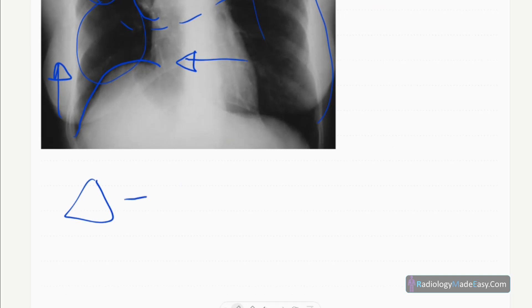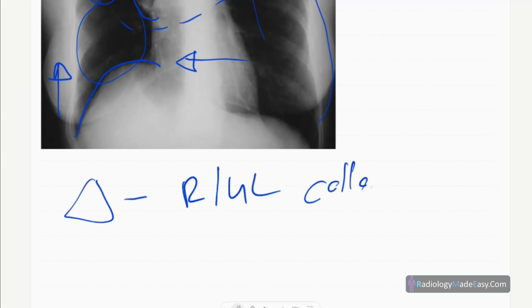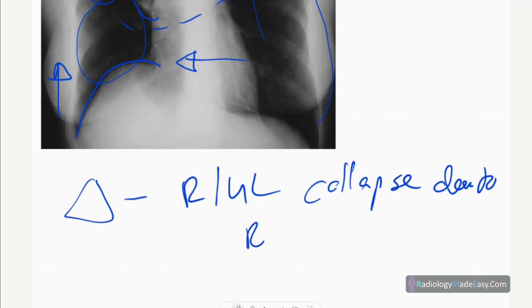In this case, the diagnosis is right upper lobe collapse, secondary to a right suprahilar mass.